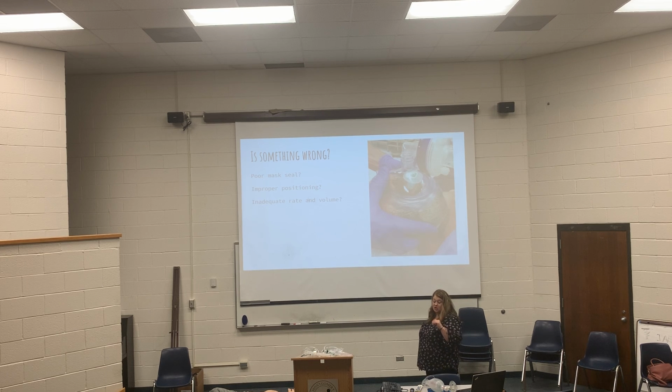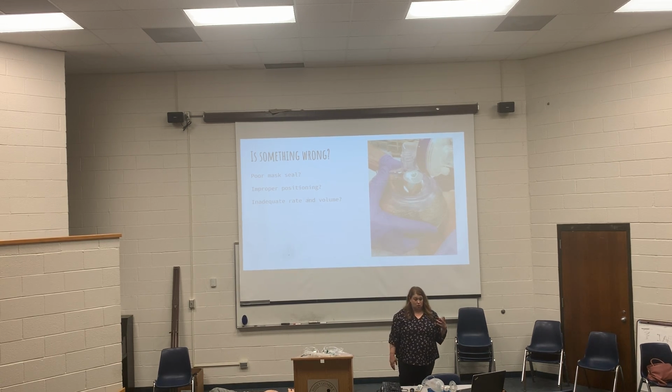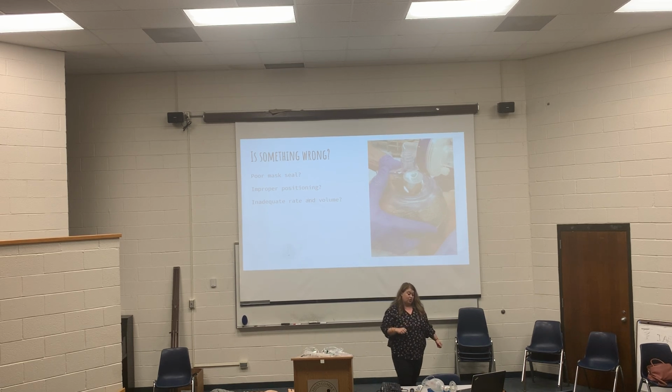And improper positioning, like we talked about, remember with kids you have to extend them, you have to hyperextend them more, do not hyperextend them, I'm sorry, because they have large tongues, so you want to have them in that neutral position. But for him, you want to have him in that sniffing position. So remember earlier he was kind of cocked. So you want to make sure to position that airway so that way it's open. Well, try again, see if that works.